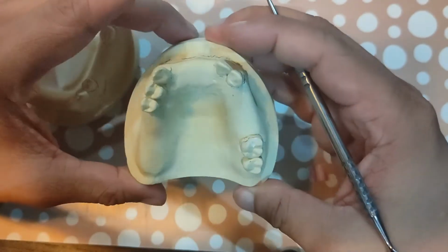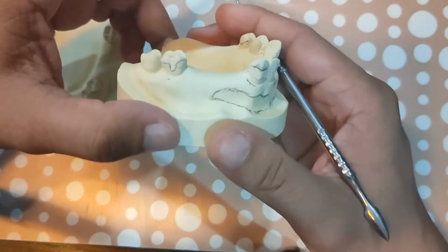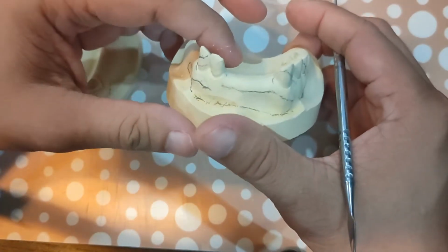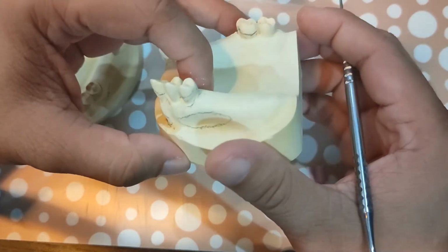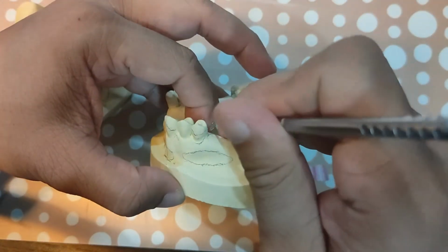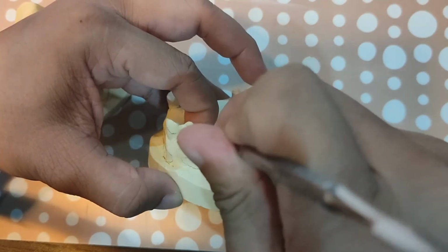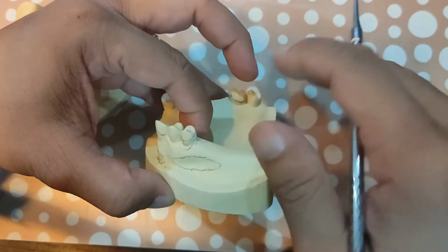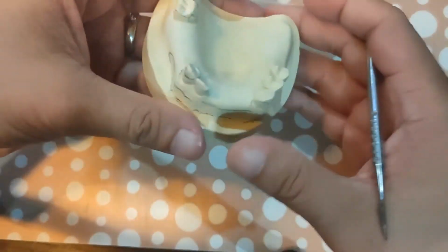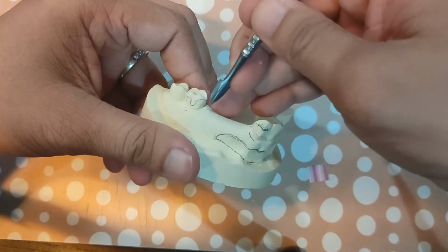Alright, so you do all the rest seats. Also, besides the rest seats, you will also be doing the guide planes. So you look at your cast, see if there's any need for a guide plane. No? I think this one needs a little bit of a guide plane because this is going to receive a proximal plate, right there, distal to the 1.5. And also on the mesial of 2.7.